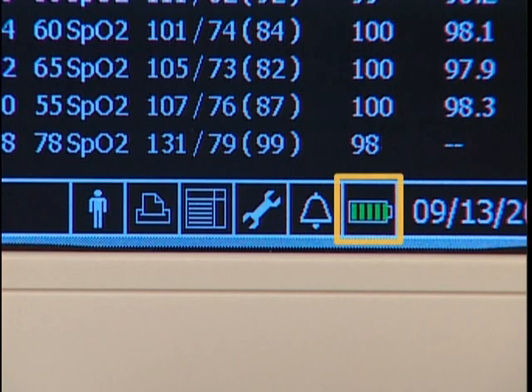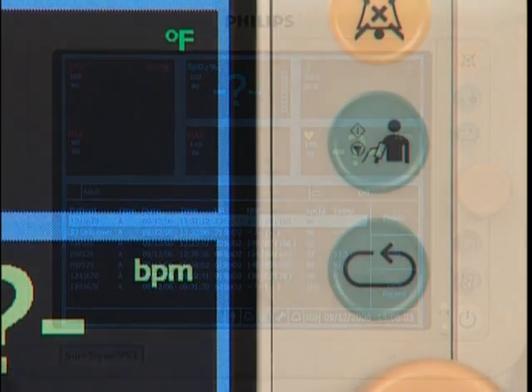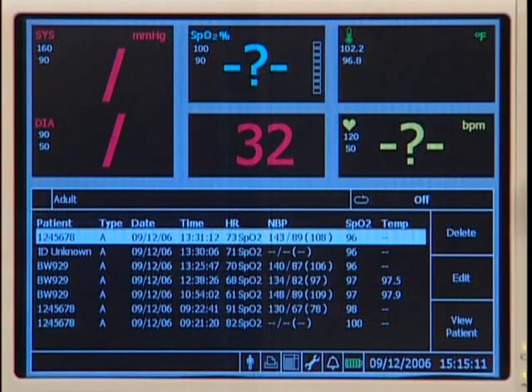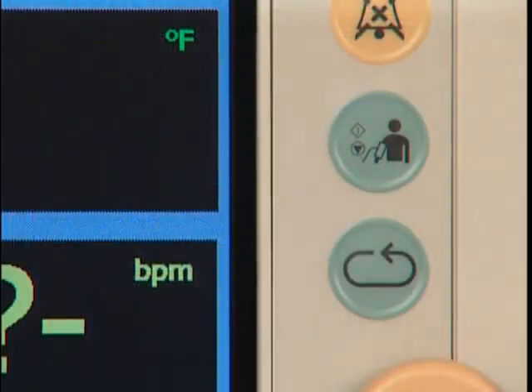This on-screen icon gives additional information about battery status, providing a graphical indication of the battery's charge level. These buttons provide quick access to key functions. This is the alarm silence button. Press the NBP button to initiate a manual NBP measurement or to activate automatic or program interval measurements. If an NBP measurement is underway, press it again and the measurement stops.